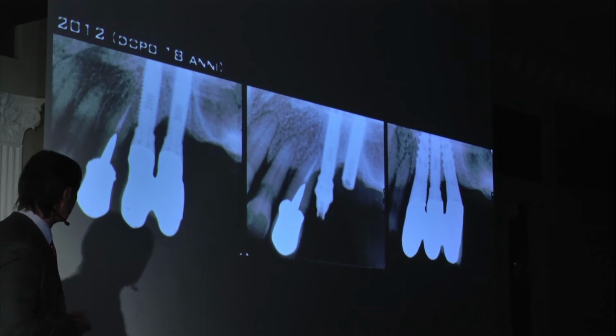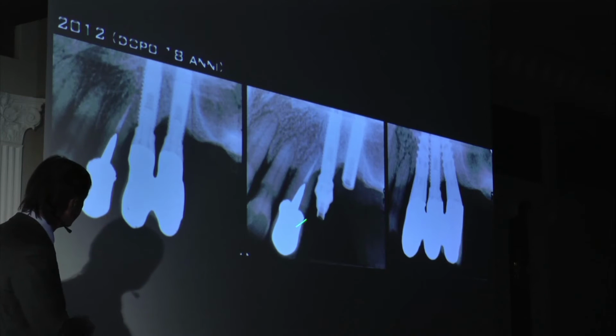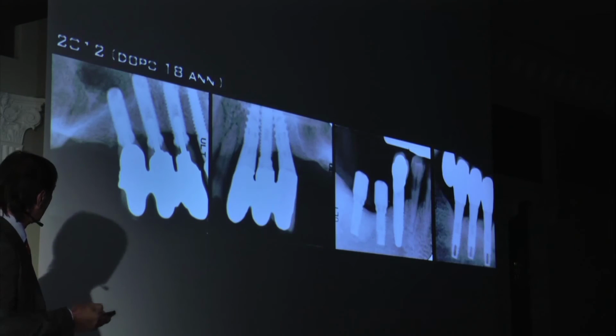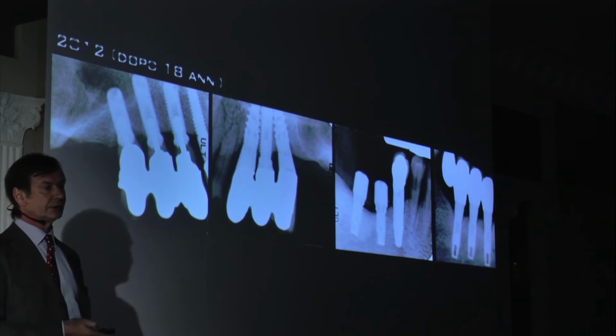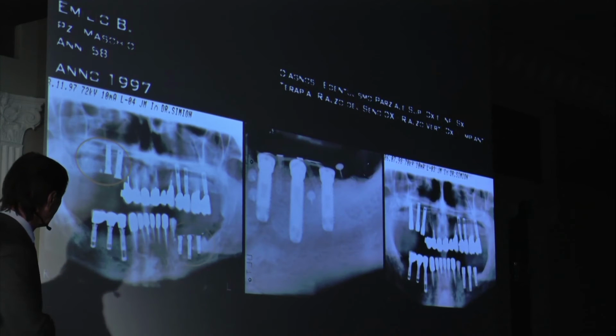I said, wow, there is a peri-implantitis. It's strange. So I removed the bridge, and the implant was broken. It was not a peri-implantitis, it was a failure of the implant structure. So after 18 years, we have stable bone everywhere, but we have lost the rough surface implants. In the same patient with the same surgeon, it means something.